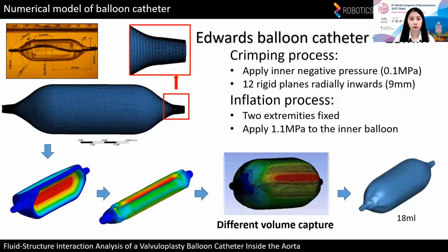The three-folded deflated balloon model was created from an unstretched inflated balloon under camera measurement and reconstructed via computer-aided design software. Then a suction, or inner negative pressure, was applied to the balloon membrane to form a star-shaped balloon, followed by an iris mechanism to crimp it into three-folded configurations, which means having rigid planes move radially inwards to crimp it. To get balloon models with different volumes, a quasi-static simulation was used to inflate a three-folded balloon with two extremities fixed. As shown in the video, you can inflate the balloon to any volume. Then different models were obtained.